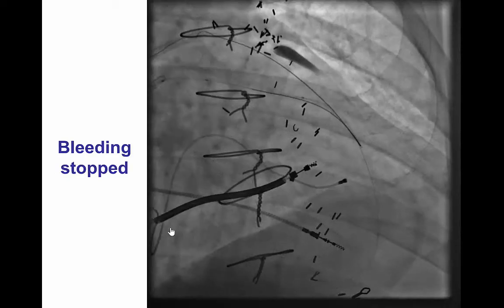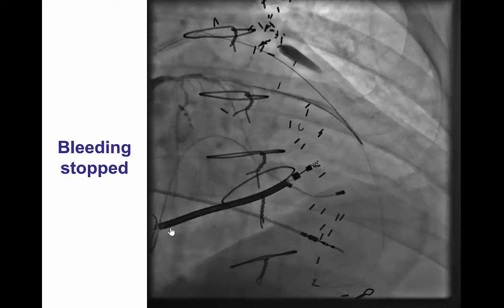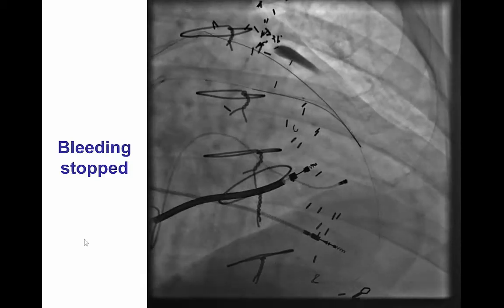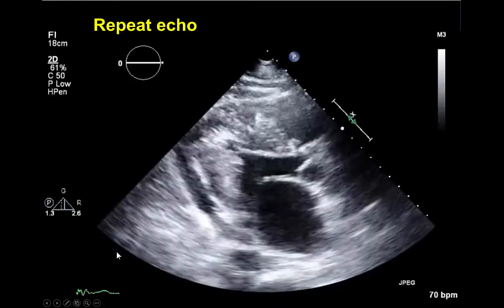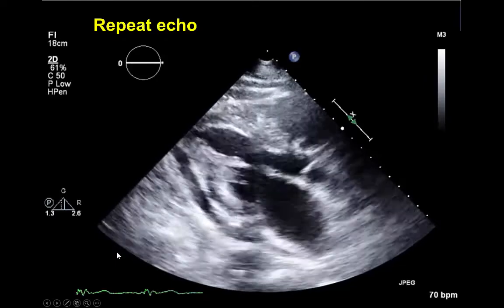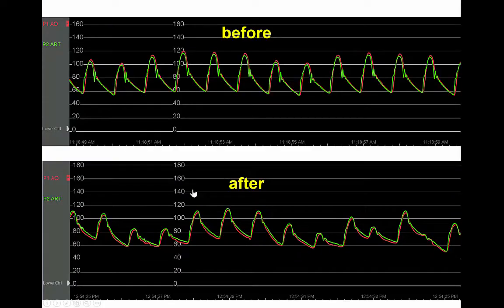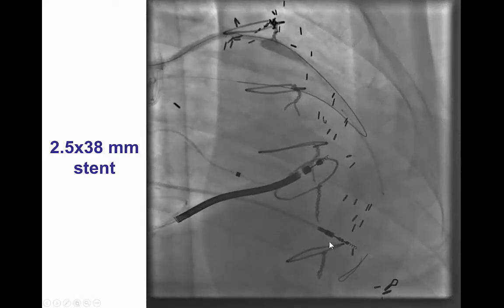The balloon was re-inflated to transiently seal the perforation, and after prolonged balloon inflation there was some improvement. However, transthoracic echocardiogram clearly showed much more effusion, and now we observed pulsus paradoxus with a significant decrease in systolic pressure with inspiration of almost 40 mmHg.